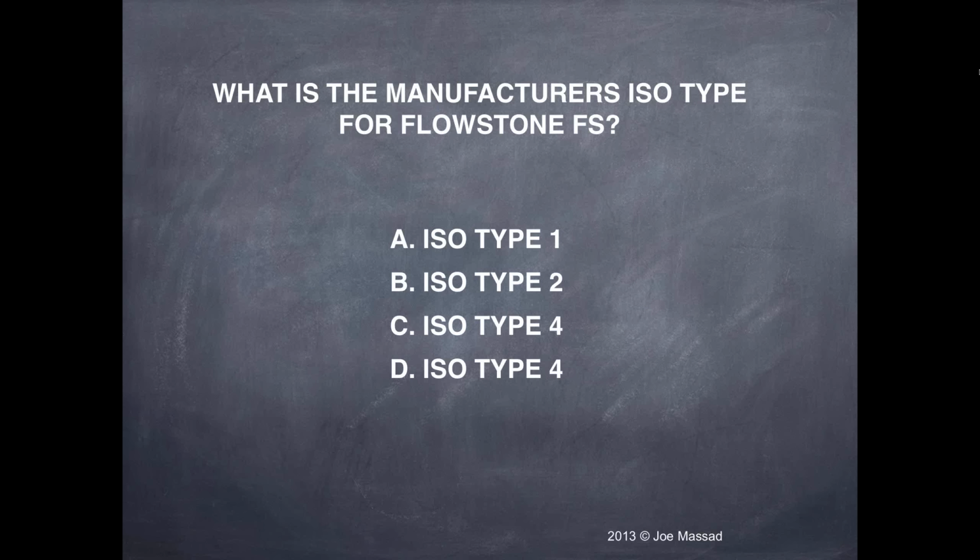So you need something that you can secure the impression. You need a container with height to it so that you can box it, close the top so that it completely encapsulates it, and completely seal the edges around the top and the bottom part of the container, so that you can pour liquid in with no spillage.